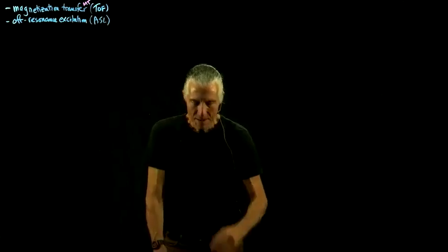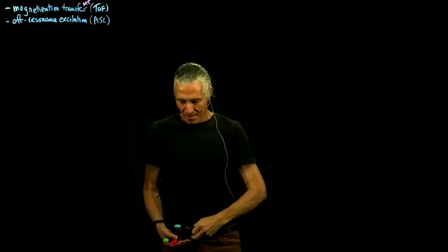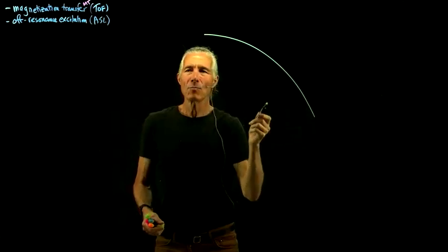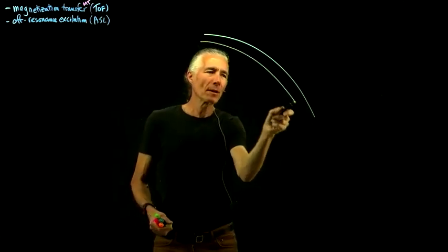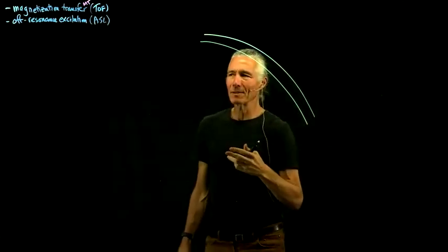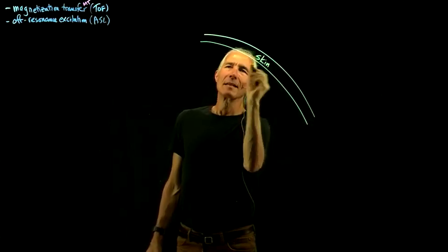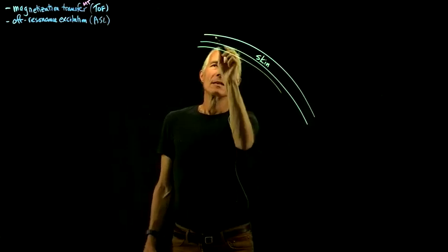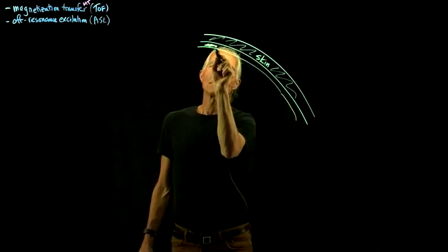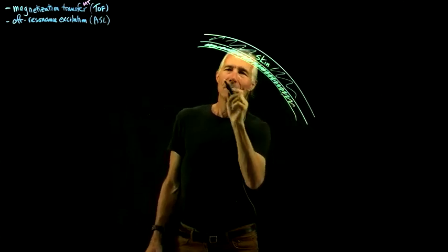One of the problems that I've mentioned several times, but we could mention it again, is if you look at any one image, two completely different tissue types might have the same color. So if you look at a typical brain image, you have some skin, which is relatively brightly colored. And then there's a little layer of fat under it that's brightly colored. Depends on how big you are. If you're really big, that can be really big.